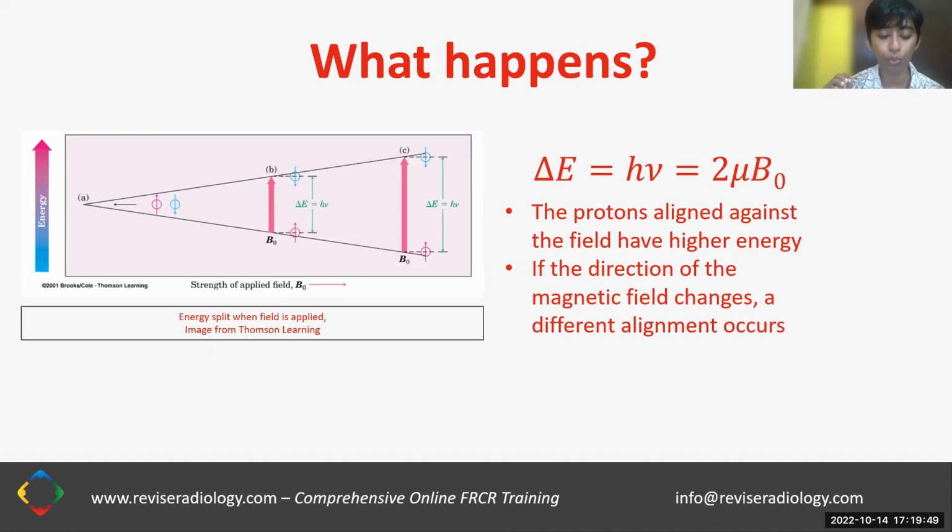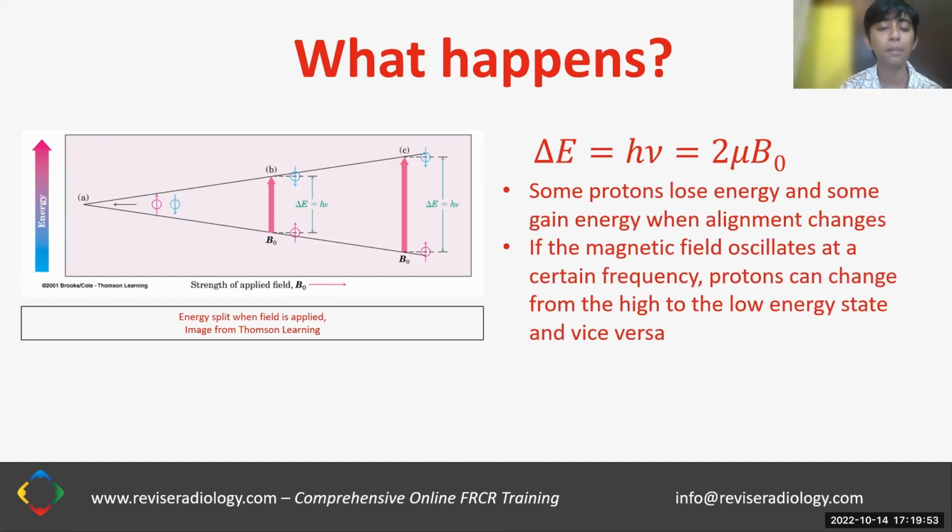So what happens then is that the energy of the protons is changing. Some protons lose energy and some gain energy when the alignment changes.